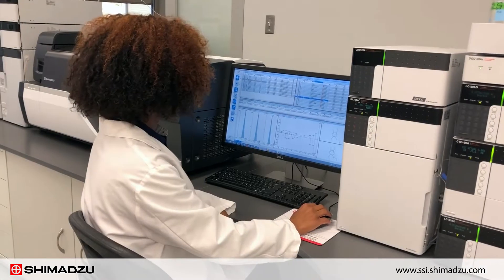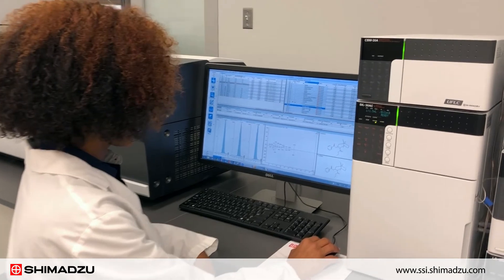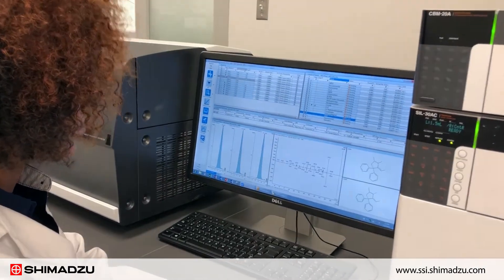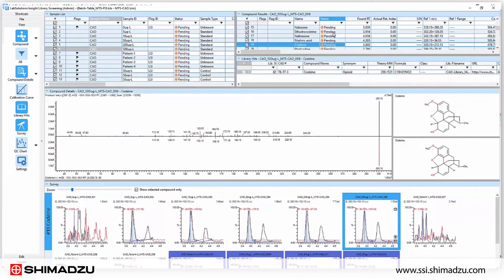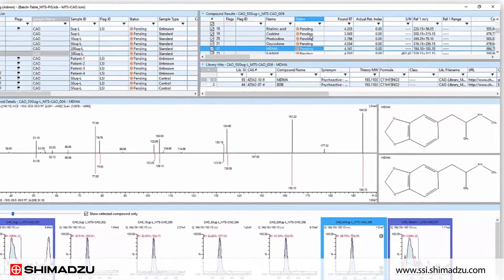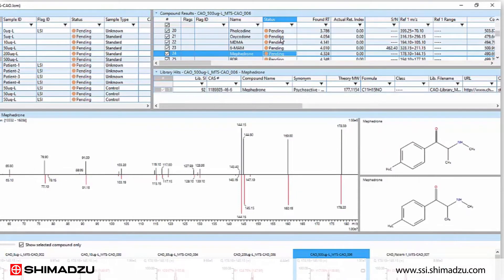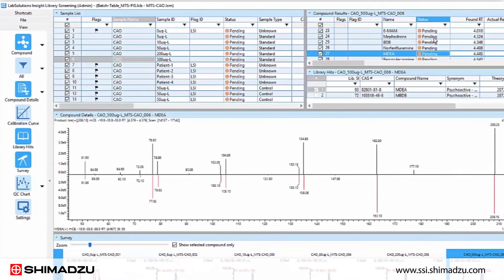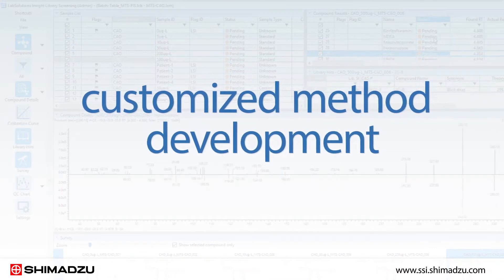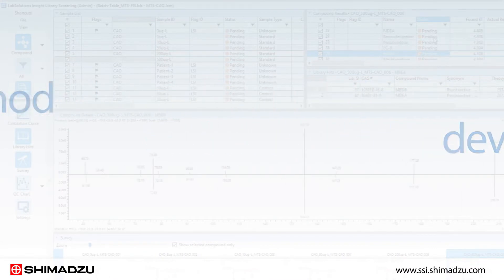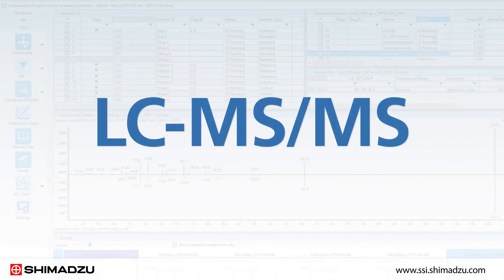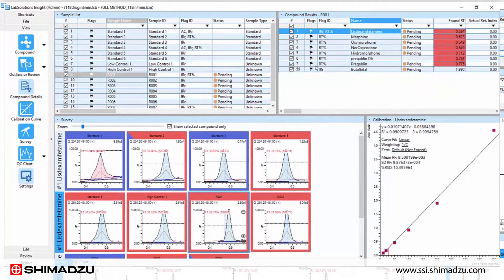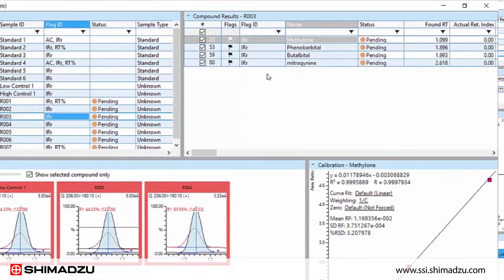With Shimadzu's forensic toxicology database, developing analytical methods is quick and easy. You can selectively build methods to streamline the analysis of hundreds of compounds in a single analytical run. The database contains not only optimized MRM transitions, but also multi-targeted screening (MTS) and a range of other data analysis conditions. To accelerate customized method development, the compound list creation tool can be used to select specific panels of targets from the library for analysis by LC-MS/MS. Rather than looking through thousands of analytes, you only focus on your compounds of interest.